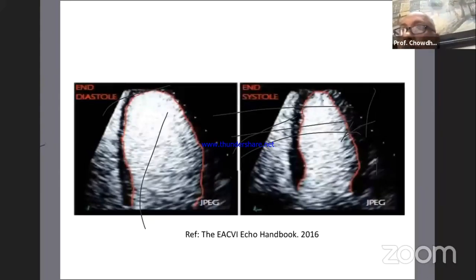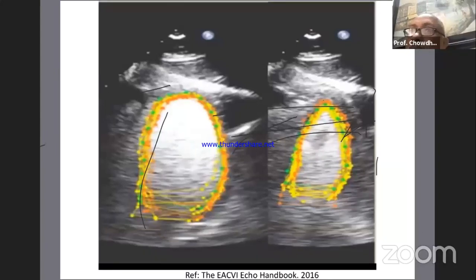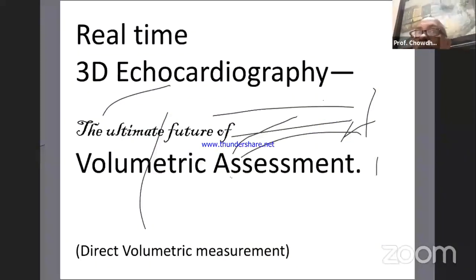so that for a few patients, especially when we do the stress echo test, this contrast is available, because here the endocardial border can be well delineated. And even then, people have shown that with the contrast, you can miss the endocardial border. So it is really difficult to have a good left ventricular quantification of ejection fraction.